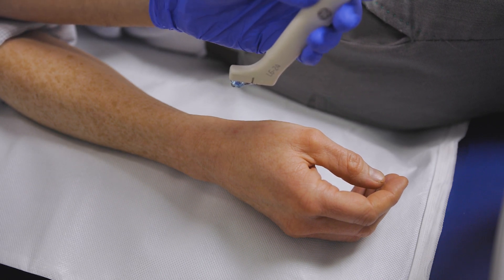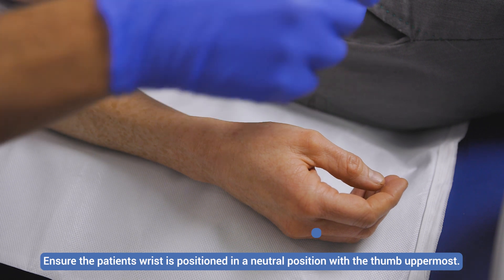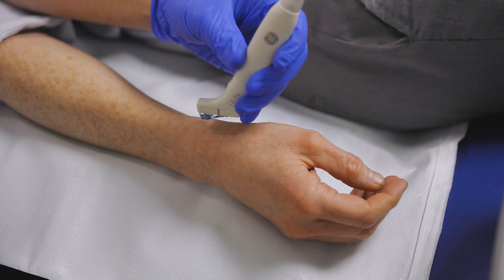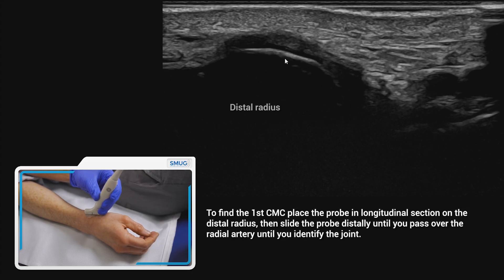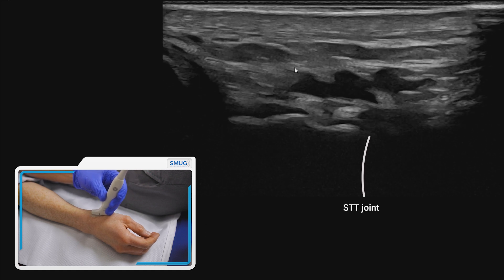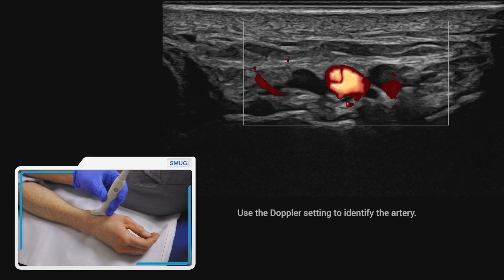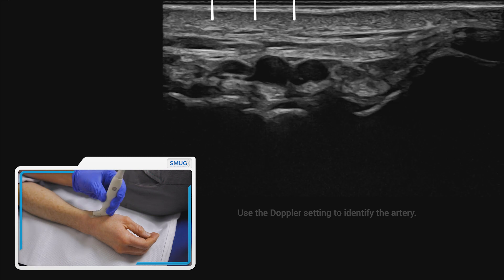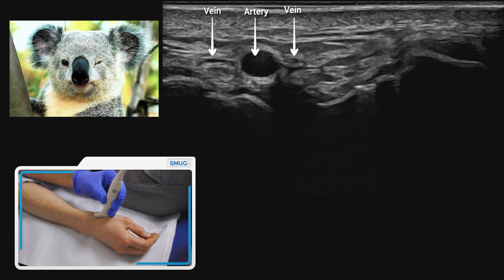Some people do struggle to find the first CMC joint. The way I find that works for me is to just pop the probe onto the distal end of the radius. You can see the distal end of the radius here. As you slide down into the hand, you should then see the radial artery, which you can see there, and obviously you've got your veins either side of that, which you can compress — and I always think it looks like a koala bear winking at you.